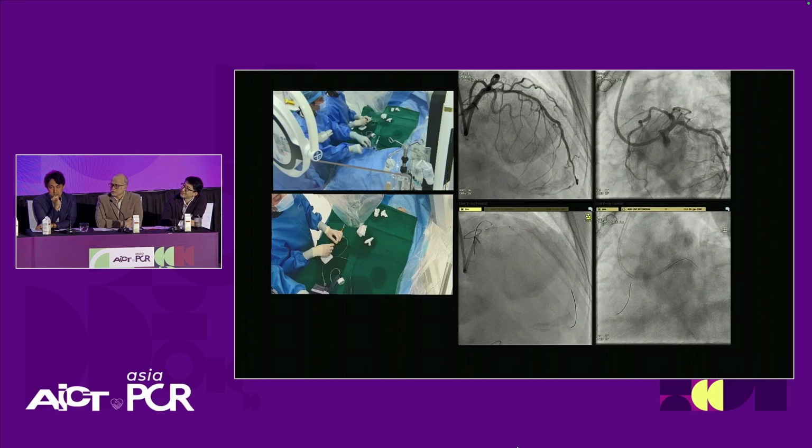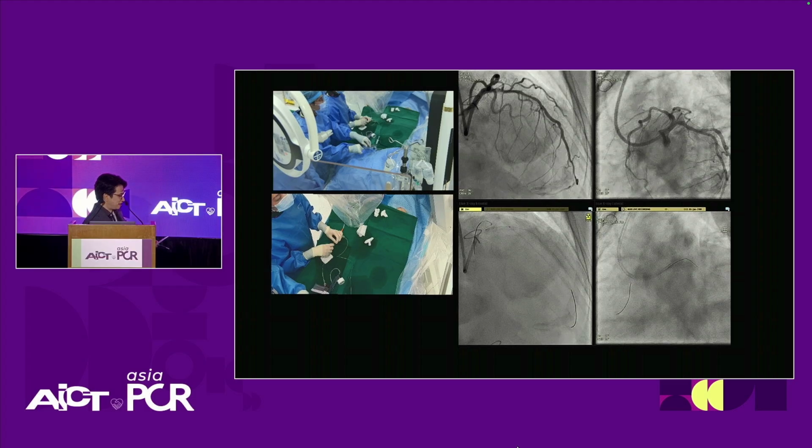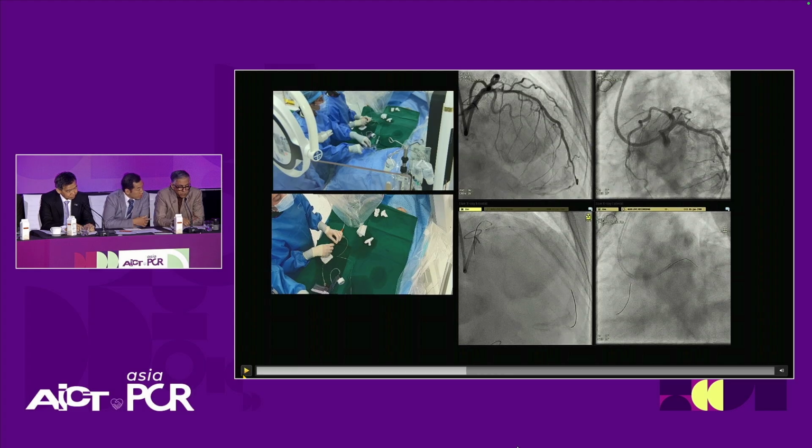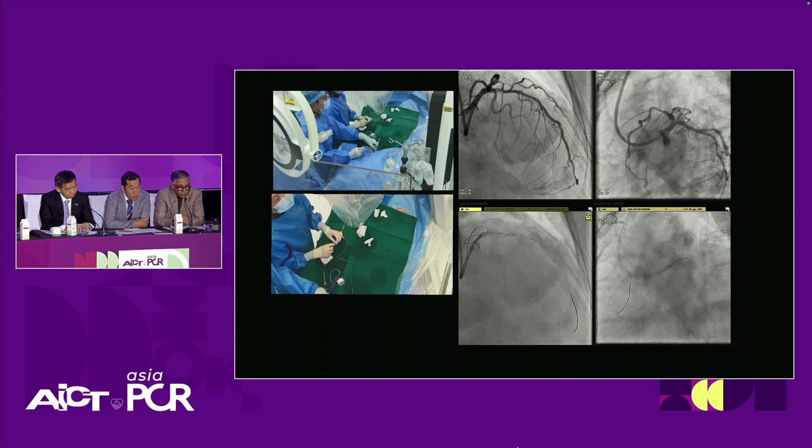All right, maybe we pause here. Chitang, you wanted to ask around what would be the next strategy, right? Whether we would upsize with a larger burr, or whether you would use a cutting balloon or other strategy for lesion prep following the description from Jason. Yeah, absolutely. We can see what you did, but maybe just a quick poll around the table. Would anyone do more rotablation now, or upsize to a 2.0, or go IVL at this point?